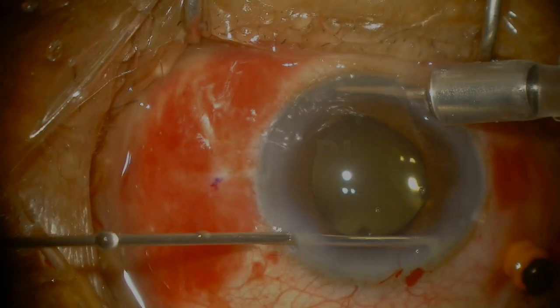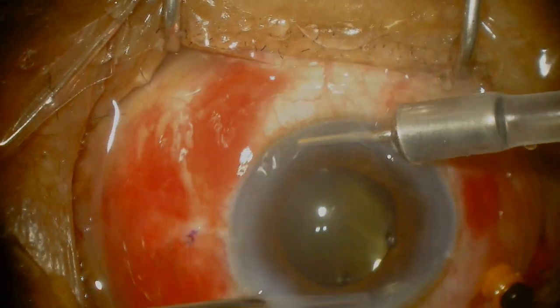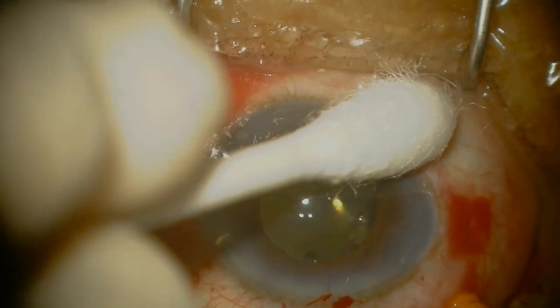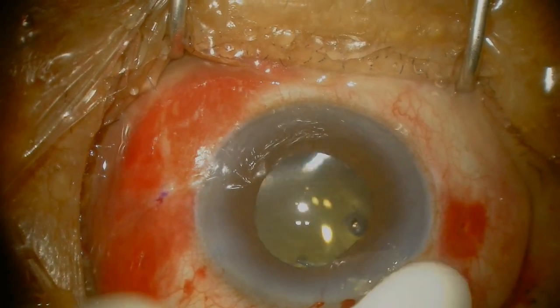My last tip here is to always do a peripheral iridectomy. Use the cutter with a low setting and do at least one PI, and in some cases where you have a lot of iridodonesis, I would recommend doing two PIs. And this is the case completed. Thank you very much for your attention.